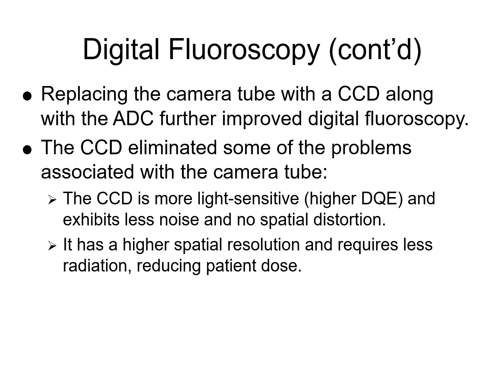Now, they used to ask about the Plumbicon and the Vidicon on the credentialing exam, but because they've been out of use for so long, I don't think they're going to ask about them. They're going to focus on the CCD, which is first generation digital camera technology, the CMOS slightly because that's second generation digital camera technology, and then finally, after the CCD and CMOS, which were built for visible light, by the way, somewhere in the late 80s, early 90s, we finally get a specific digital imaging system for radiography, not just replacing photographic film and visible light pictures.